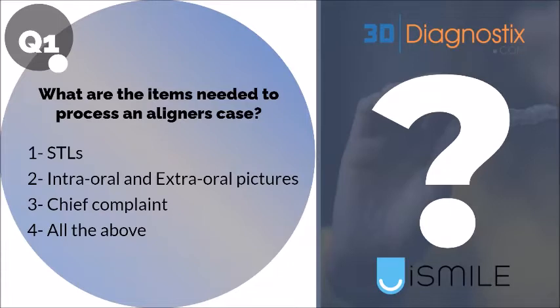Okay, we have 100% saying all of the above. Exactly, this is absolutely correct. We need STLs, of course, that we're going to work with, intraoral and extraoral pictures, and the chief complaint of the patient or the doctor's note. So it's correct that it's all of the above.